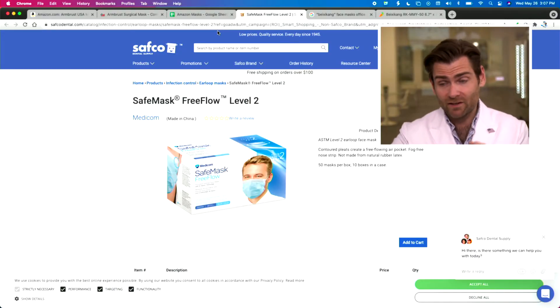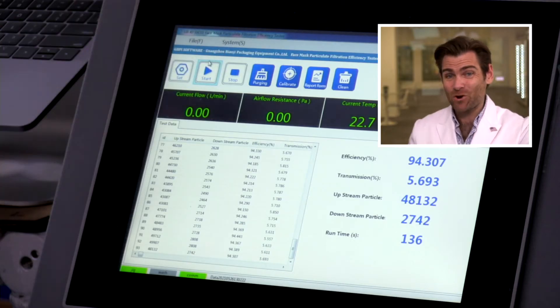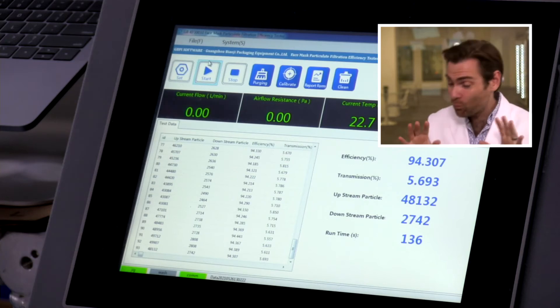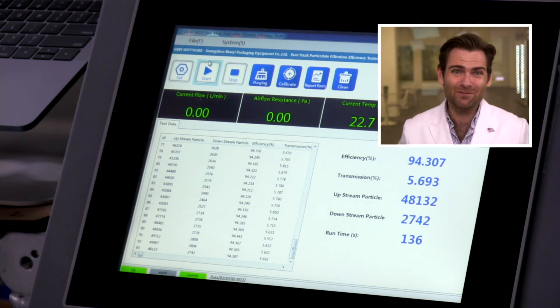But does any of that matter if it doesn't protect you? Now remember, they're making claims on the website, they're making claims on the box: 98%. That's what they're claiming. Are they going to hold up? Nope. Way off. Now granted, we only tested one mask here, but this is pretty bad. 94.307. For an ASTM level 2 or 3 mask, it's got to be way better than that. There's no way that you're testing this entire box and that thing is coming out at 98%. I think they're kind of phoning it in a little bit. That's bad. This is a medical product, they're making a claim. I think this is an FDA-cleared mask and they're making a claim that it's 98% and it comes in at 94. That's not good.